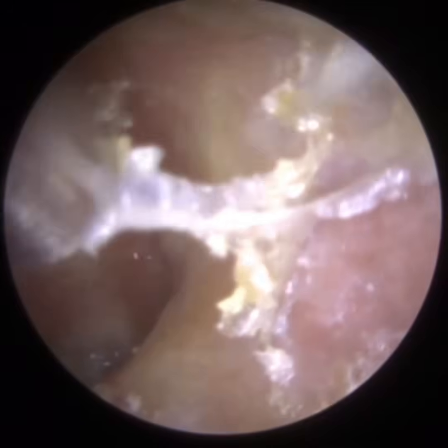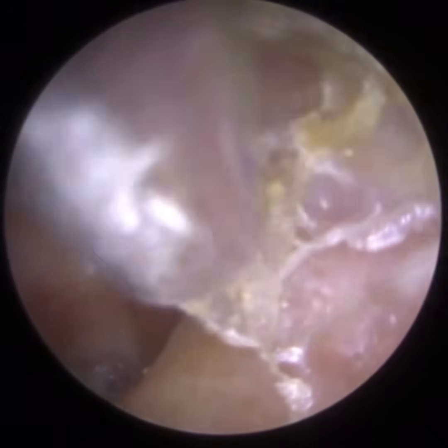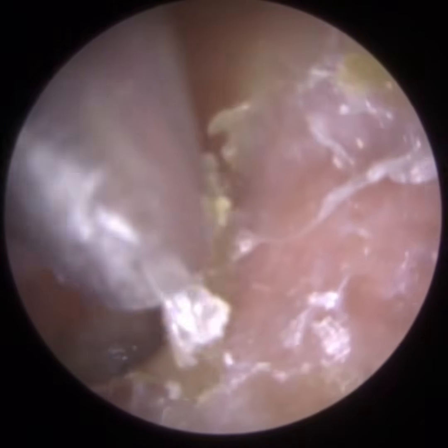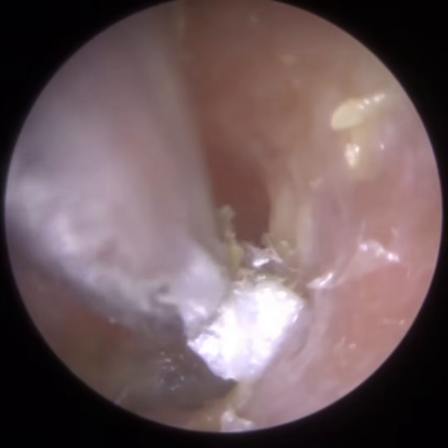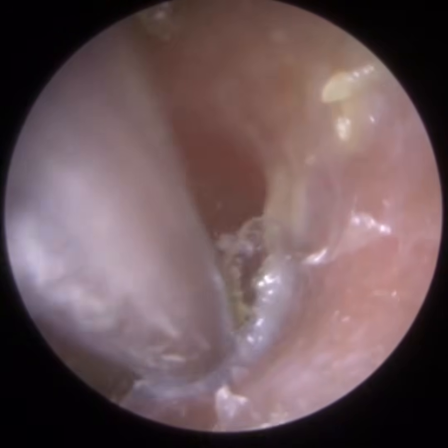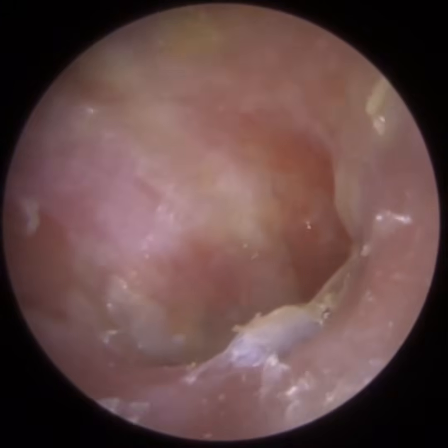So we just come back out near the entrance again on the posterior canal wall. I'm just using a full Zollner suction probe here, trying to elevate the skin. You can see I'm going to peel it all the way towards the patient's eardrum. It's this skin that I'm peeling now. I'm going to use a fine end. When I remove it, you'll be quite surprised. I was referring to this earlier.